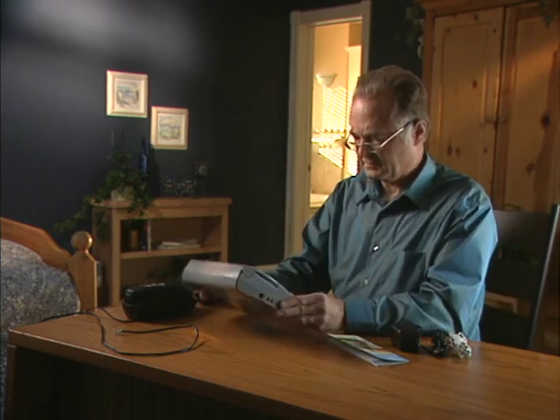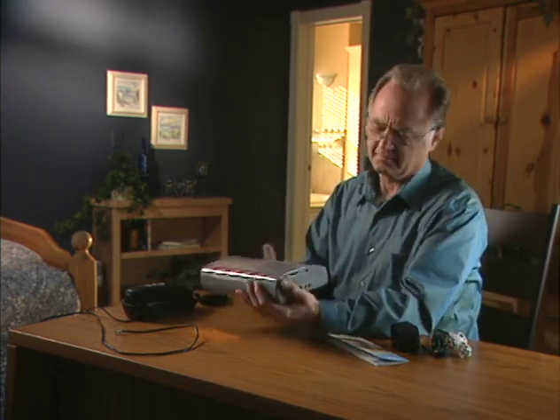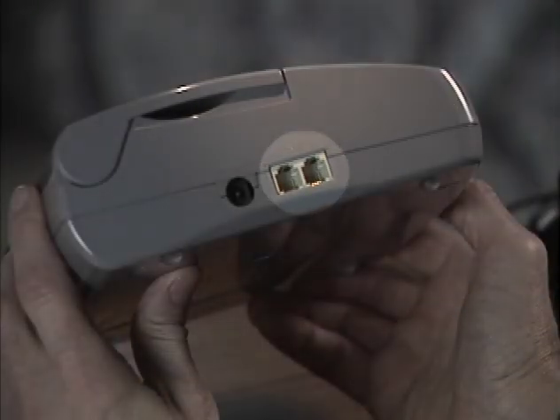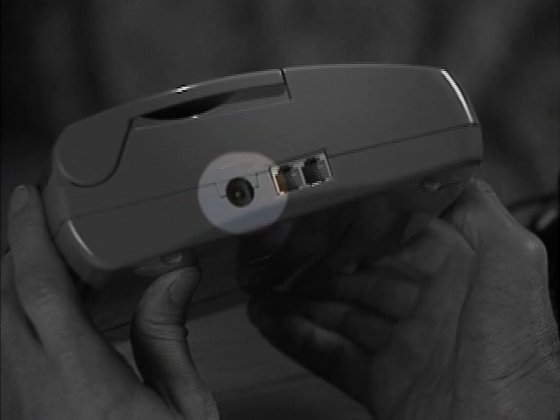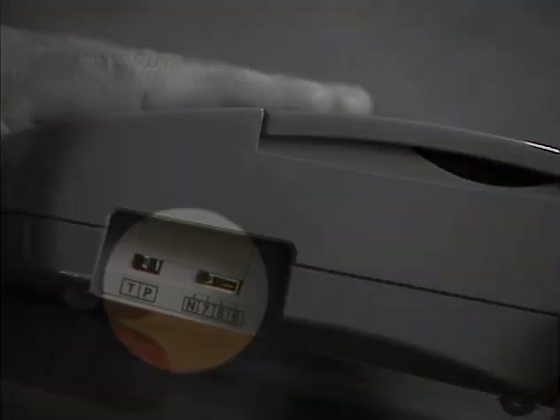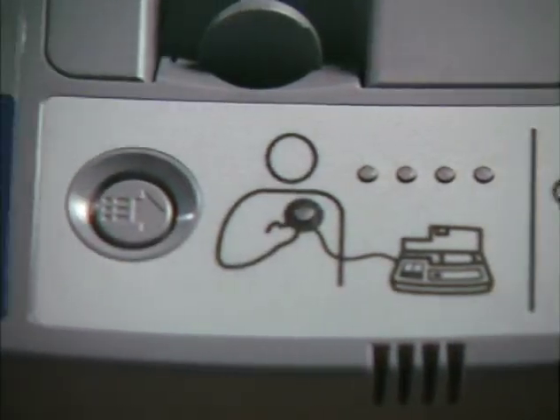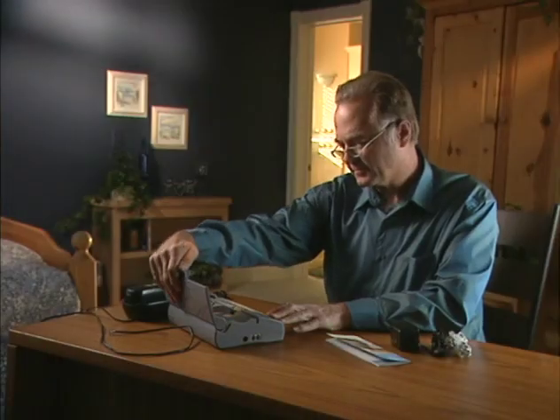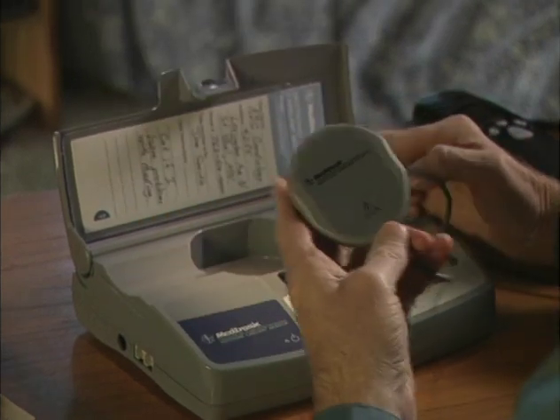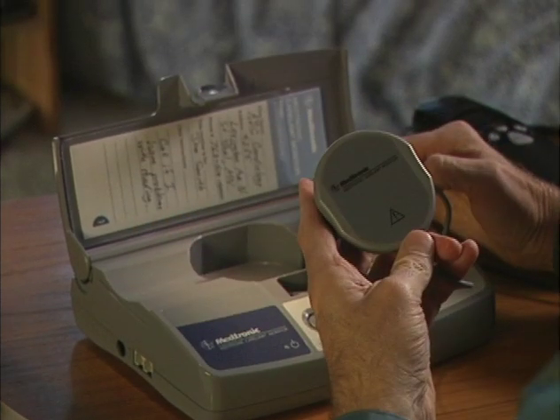Once you have found a good location for your monitor, you may continue with the setup. Look for the following parts of the monitor: two telephone plugs on the left side of the monitor and the port for plugging in the power cord, the two telephone line switches on the right side, and the display panel on the front of the monitor. Inside the monitor you will find a cable attached to the monitor with a disk at the end — this is called the antenna.